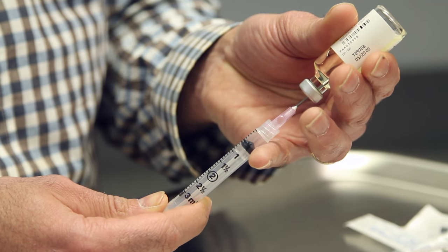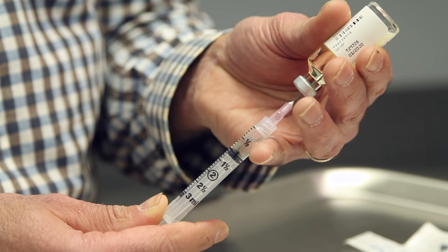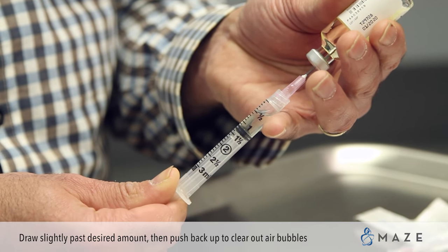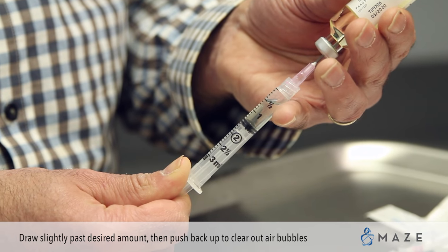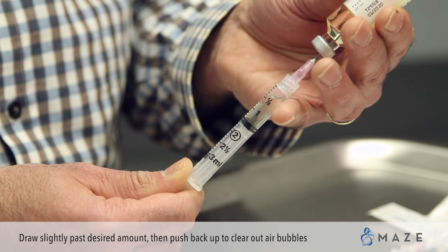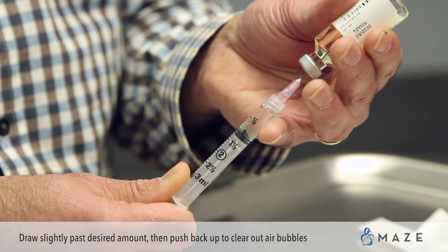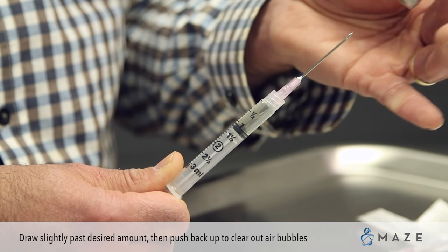In today's example we're going to draw one cc of medication. Draw past the one cc mark to about one point five, then push up on the syringe to clear out any air bubbles.